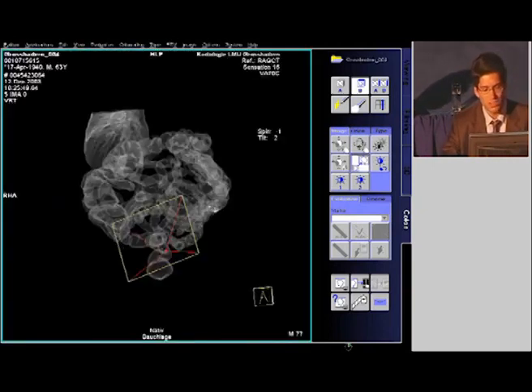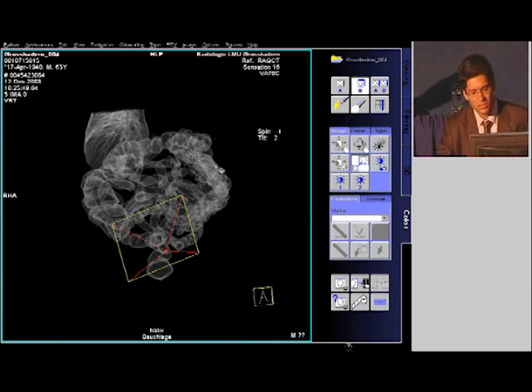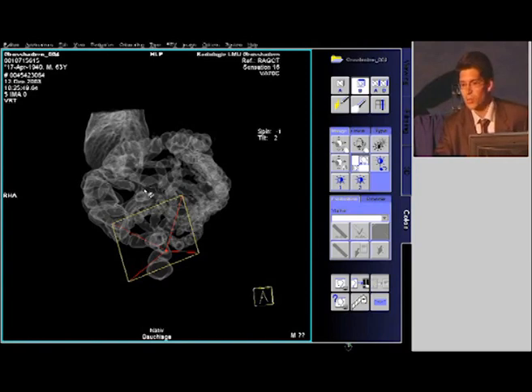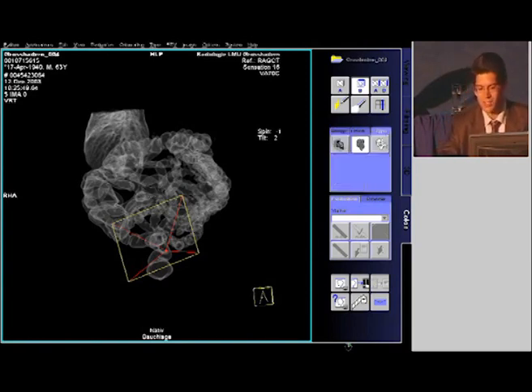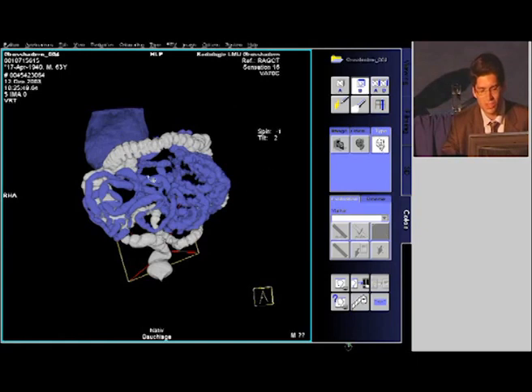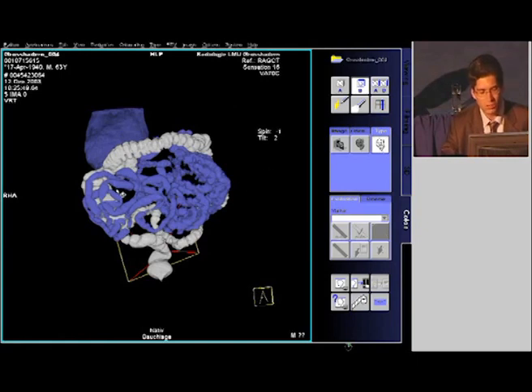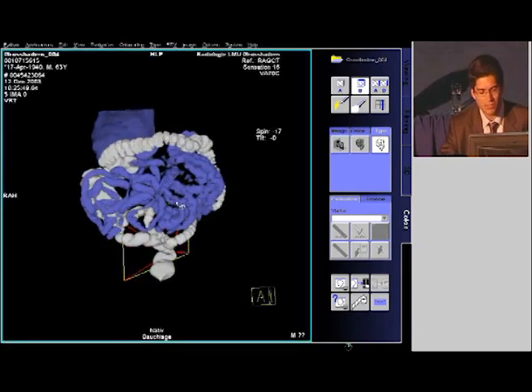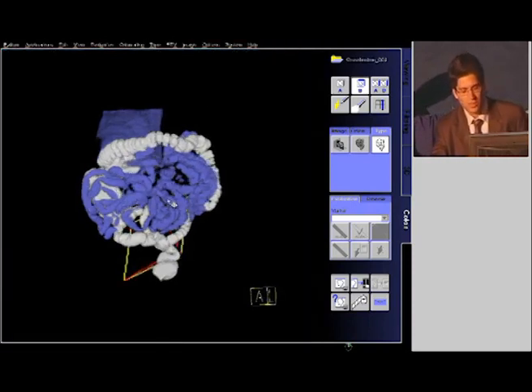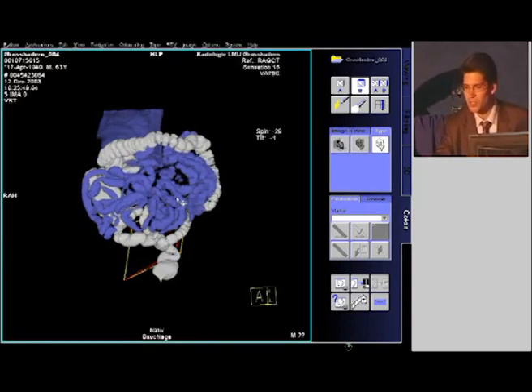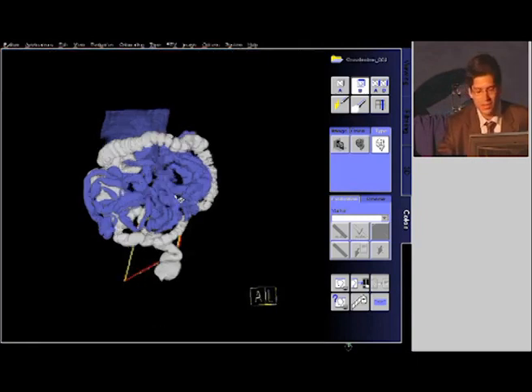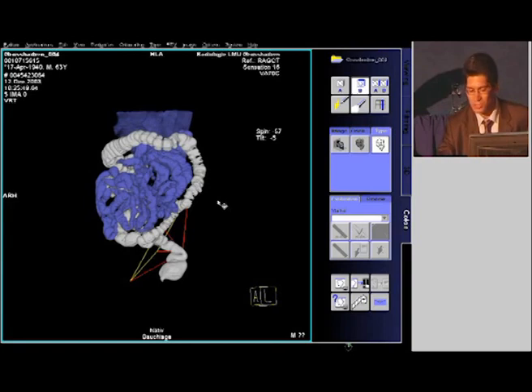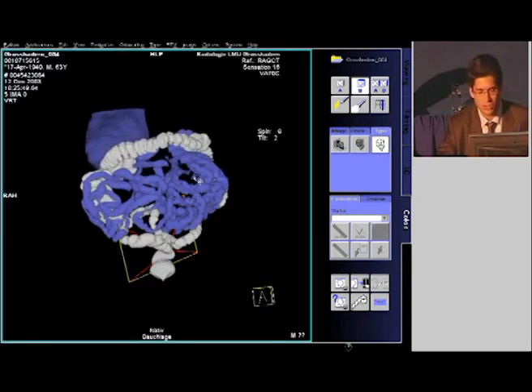I look at this kind of simulated double contrast in an enema view here in this patient. The colon is not too well distended and there is a lot of air in the small bowel. You can enhance this by clicking on this button, and everything that does not pertain to the colon is shown in blue, also the lung base here. This patient did indeed have an insufficiency of the ileocecal valve, but it does not prevent a very nice evaluation of the colon. This patient shows all important pathologies in just one examination, which is why I chose this case.